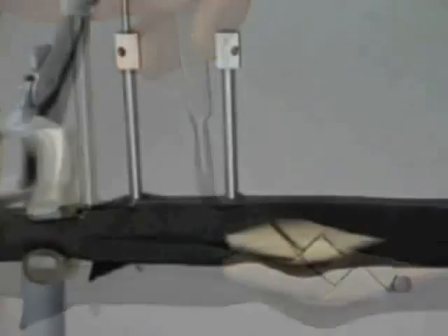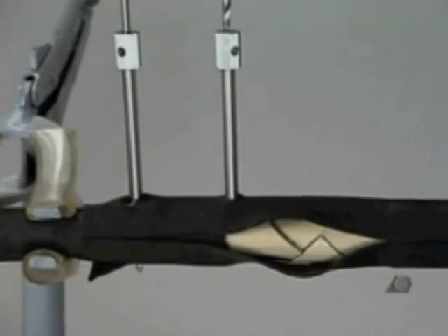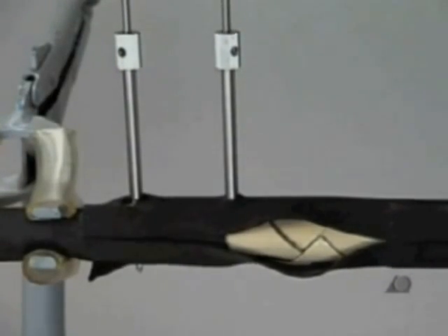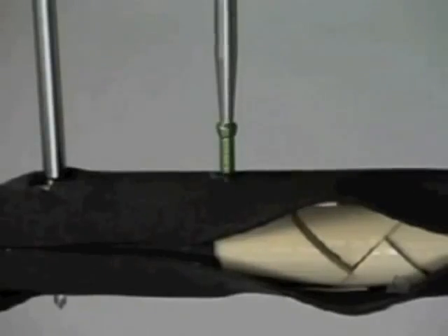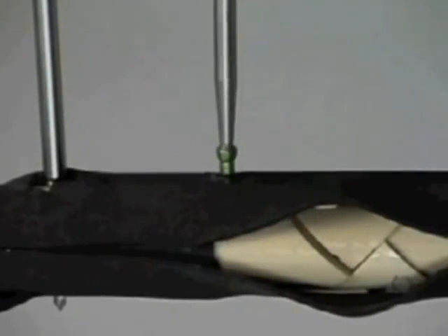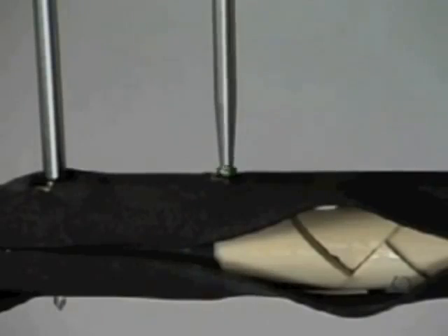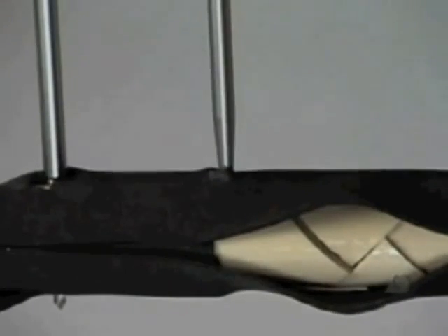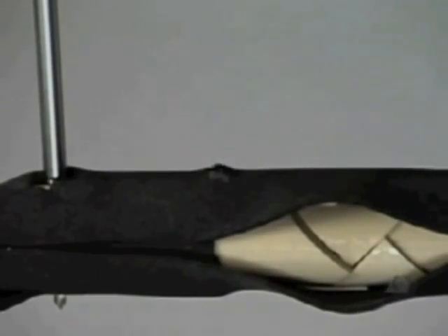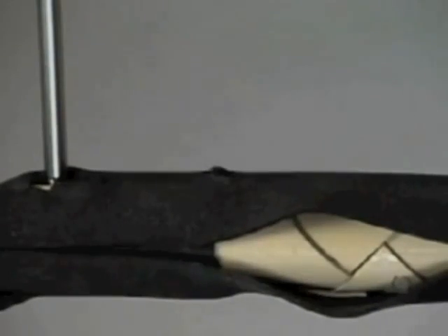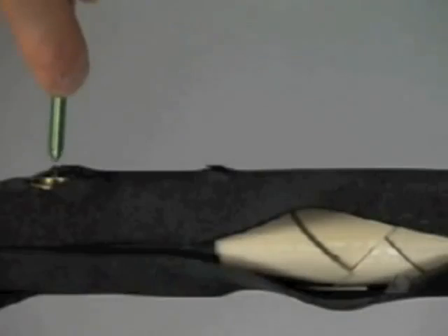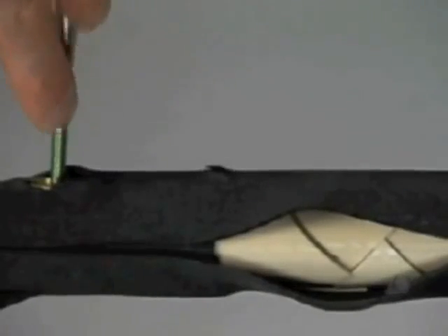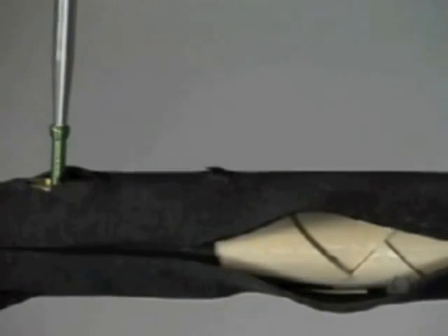the second drill sleeve is carefully inserted and the second 4.3 millimeter drill bit is used. The corresponding self-tapping locking head screw is inserted. Only now are the drill bit and drill sleeve removed from the end hole and another locking head screw inserted.